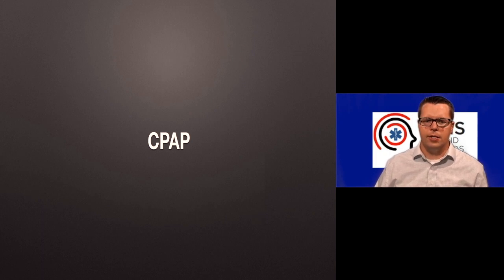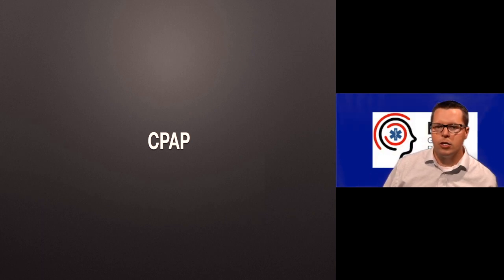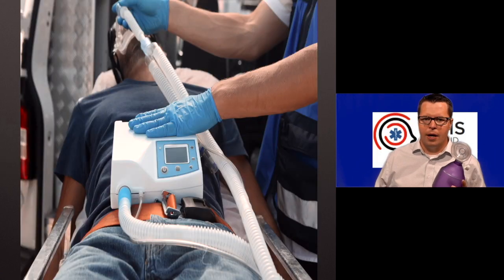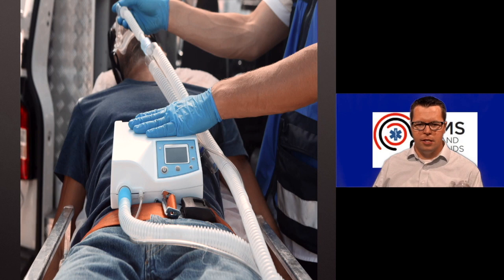Real quick, let's hit on CPAP, because that's the other thing that some ventilator systems will do that you may not think you'll be able to do with a bag. Again, usually it's sort of a complex thing. It's this machine that delivers positive pressure, and we don't really know how it works, or if you've got a pneumatic-powered system, it looks something like this, and it looks really complicated. But when you break it down, what is it actually?